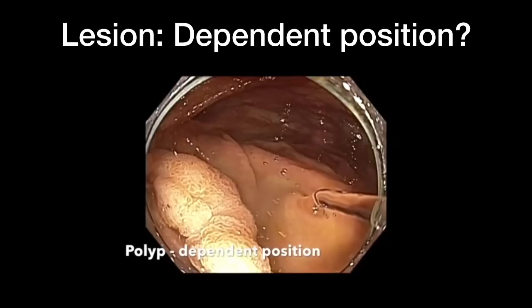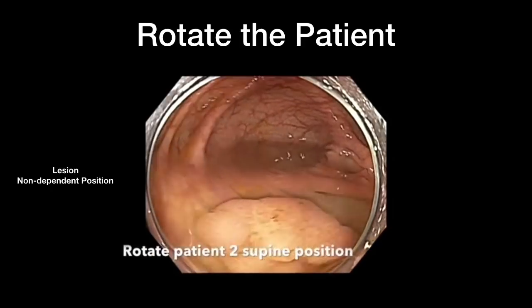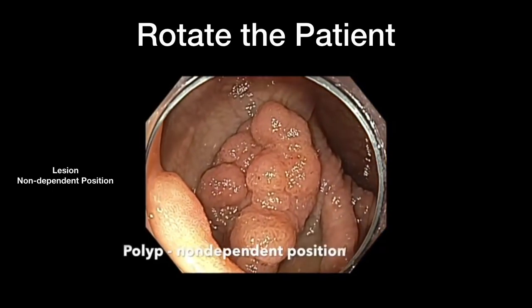The reason it is important to find out whether a lesion is dependent is because if bleeding were to happen after resection, you will not be able to find that bleeding vessel as it all gets submerged in a pool of blood. The simple trick is to rotate the patient. If the patient is in the left lateral position, make the patient go to either supine or, in some cases, right lateral position. We rotated the patient to supine position and it made all the difference — the fluid moved away and the lesion became non-dependent, so if bleeding were to happen, you can easily find the bleeding source.